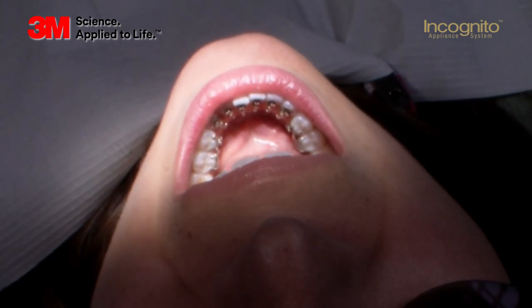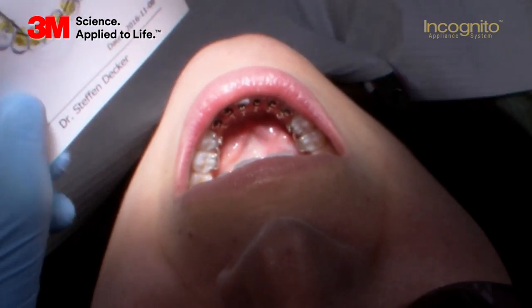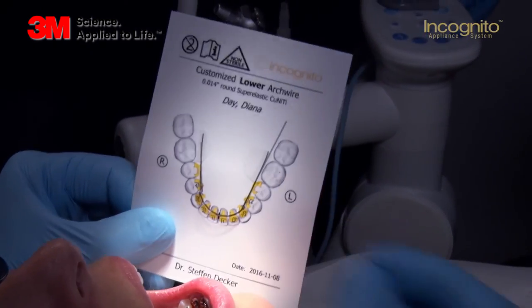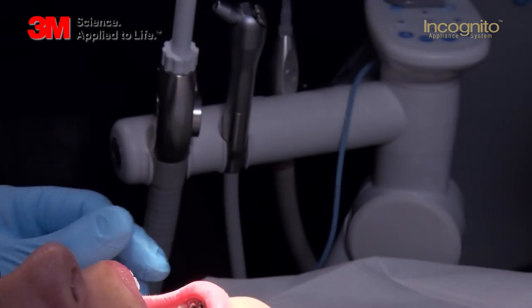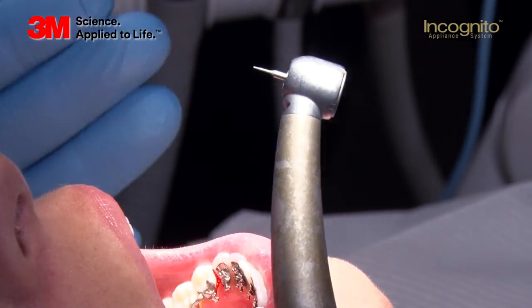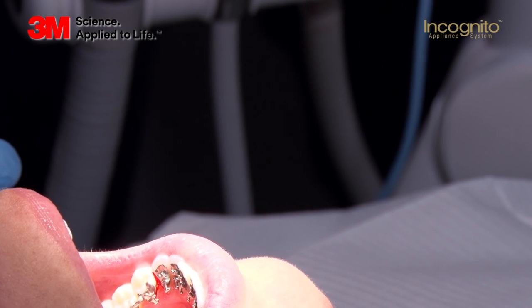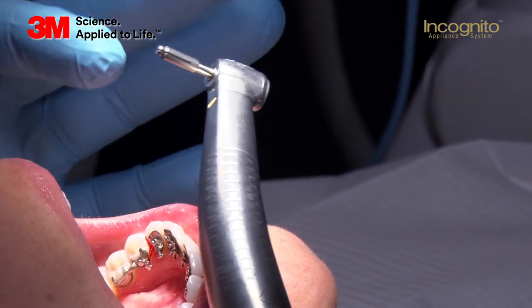In most cases, there is a need to do some interproximal reduction. If there is a need to do so, it will be mentioned on the template of the individual arch. As you can see here, there is no sign of stripping, which means there is no need to do any kind of stripping on her teeth. But if you do need to do so, there are certain instruments available to help you do the slicing. After doing the IPR, you have to polish the surfaces with a soft flex disc attached on a mandrel.